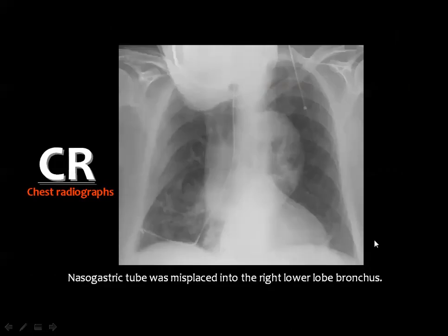Then the patient position will also affect the radiographic projection. Sometimes you are not able to elevate the patient's neck so that it will not cover part of the apex of the lung, and there may also be some inevitable tilt of the X-ray tube, so that the projection is not the optimal one.